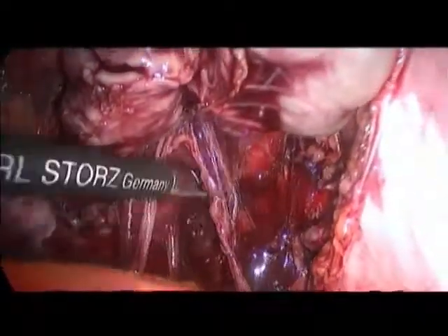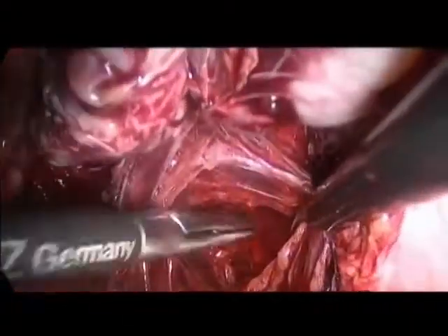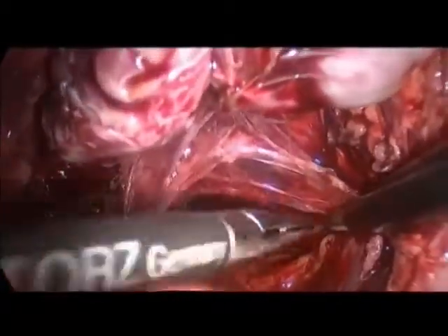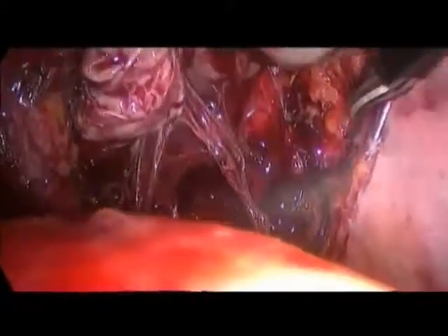But now I think we are more precise. I think it's not the most important point. Okay, you see the procedure is over. We inflate the balloon.